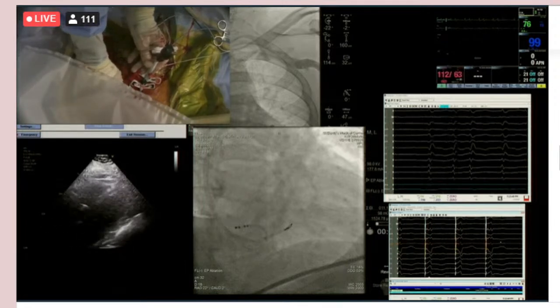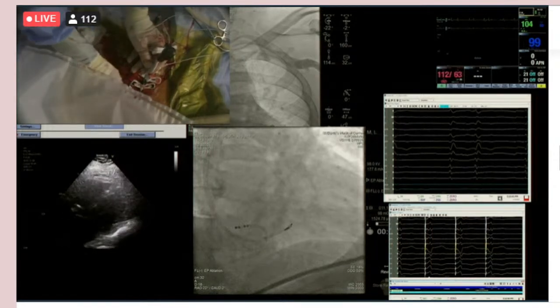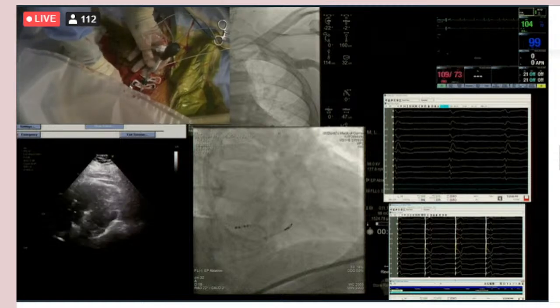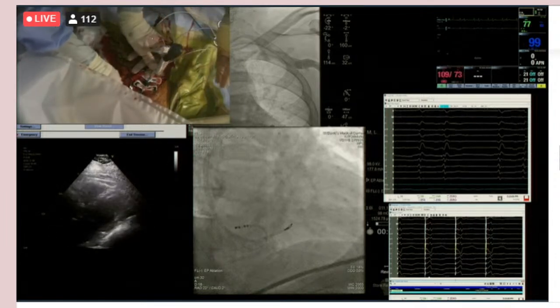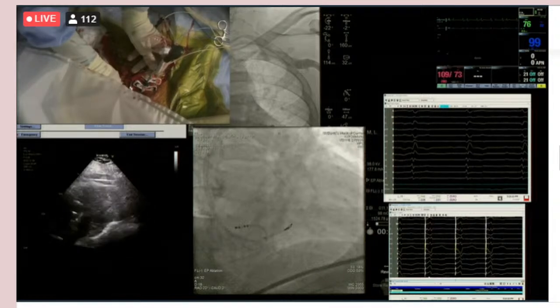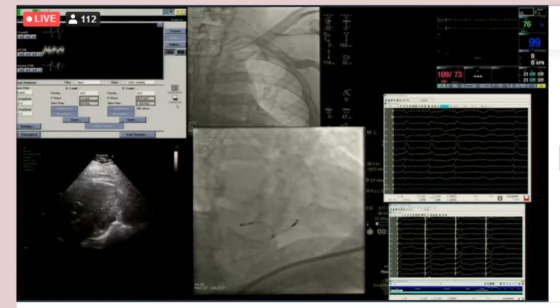Yeah, is there a way to show the Medtronic programmer? Can you guys pipe it in with the signal? Yeah, okay, hang on. Unless you're using the laptop, the iPad one? It's on the top left. No, they've instead put the wound for some reason. The wound is actually not particularly interesting, but oh, there it is. Okay. Medtronic programmer is. Okay, so go ahead and pace there, please.